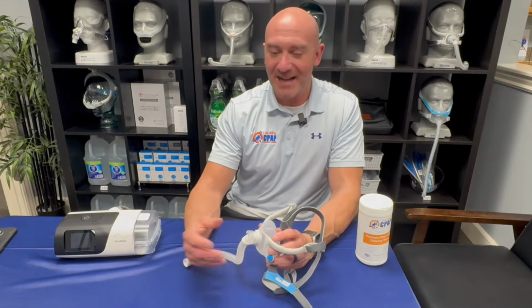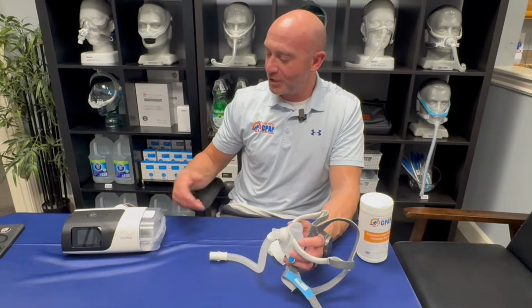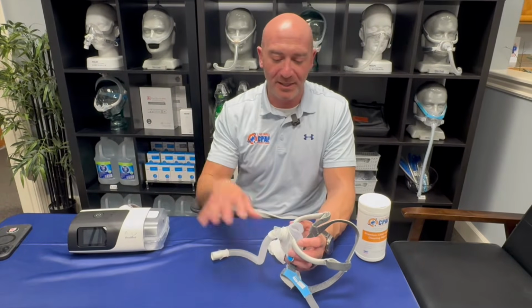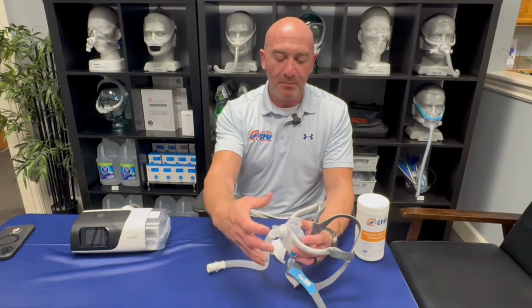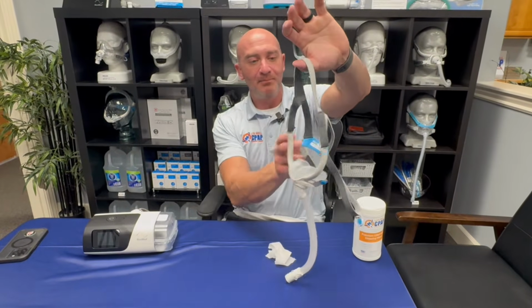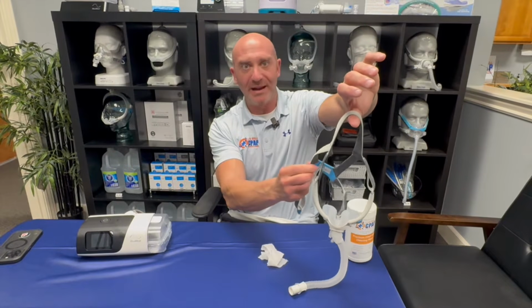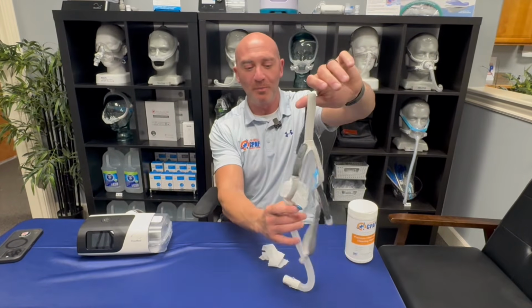So dish soap is fantastic. It's going to pull most of the oil off of it. Leave this tube attached, disconnect it from your CPAP tubing and clean that separately. But you can wash the whole thing, and then you can hang this up to dry. And you can leave the headgear on here, because you want to get the oil out of the headgear, and the warm soapy water will help that as well.